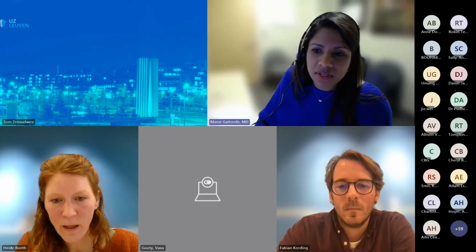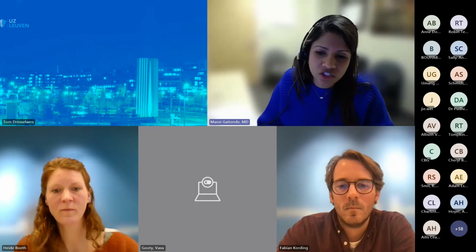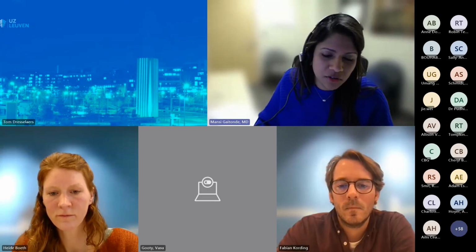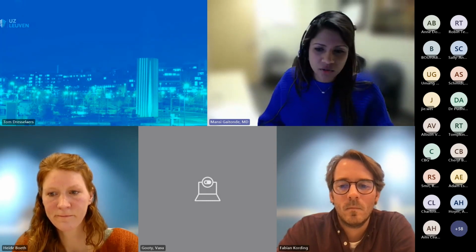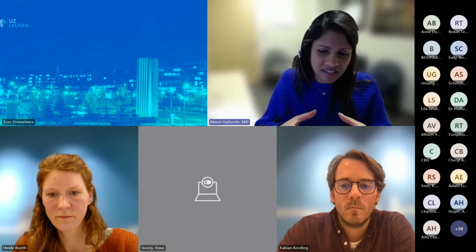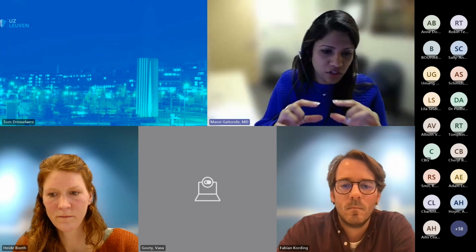Yeah, I'm happy to send that over. We do obviously try to get a smaller slice thickness, and I'm happy to send over our exam card. If you CC me your email, I can send you what we have. But again, when we're using our standard balanced SSFP images, a lot of the problems are still just the fetus moving. So I think you have to be really careful about the area that you're trying to image, and when you have a clinical question, sometimes you have to change where you're starting, where you're finishing.